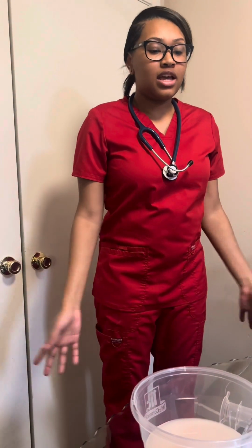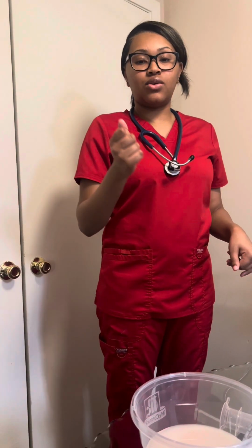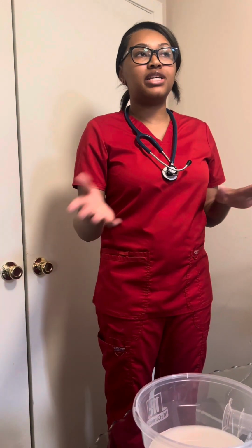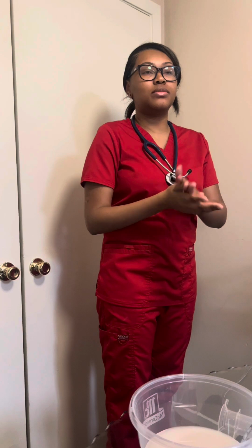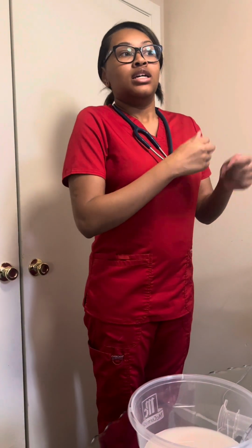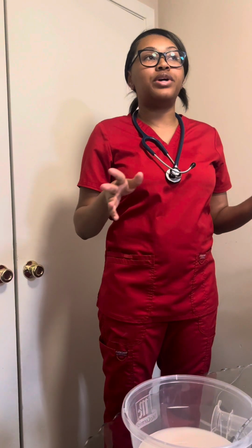And then I would lower the bed to the lowest position, raise the rail, leave the call light in reach, ask the patient if they need anything else, gather my supplies, wash my hands, take off my gloves, wash my hands, and I would document intake, output, as well as the water that was given.